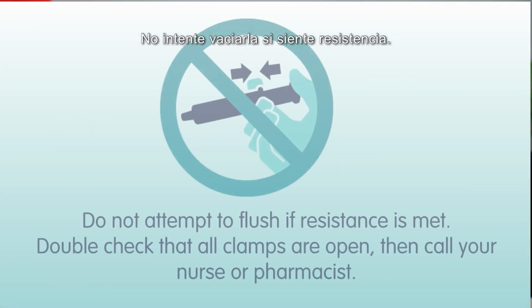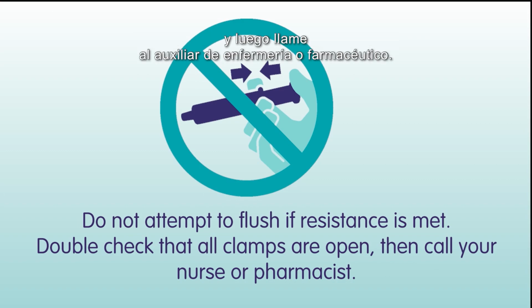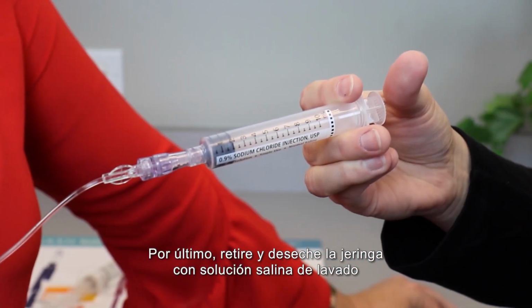Do not attempt to flush if resistance is met. Double-check the clamp is open, then call your nurse or pharmacist. Lastly, remove and discard the saline flush syringe in a trash container.